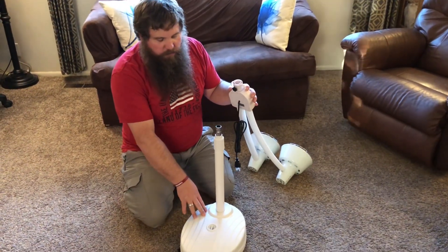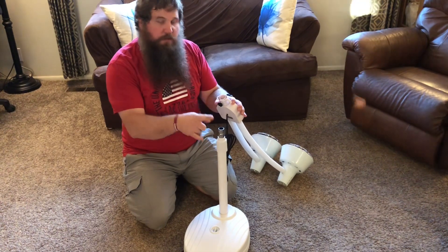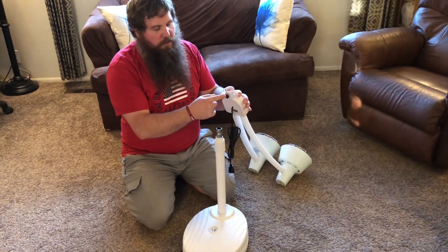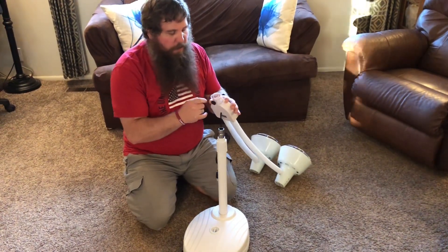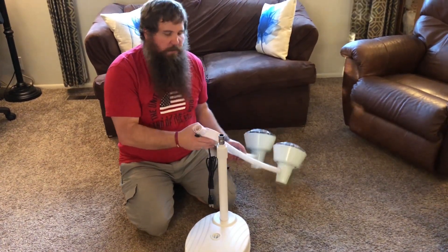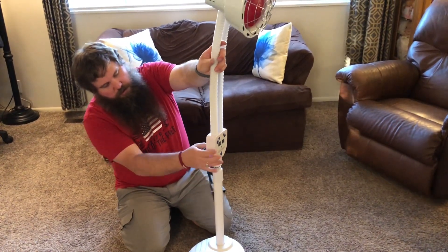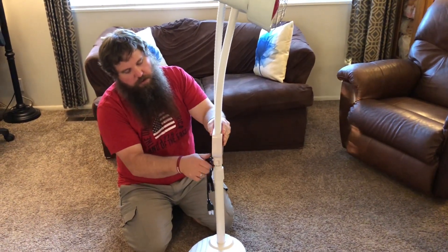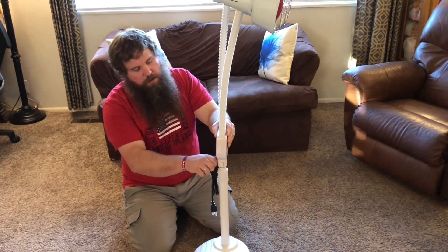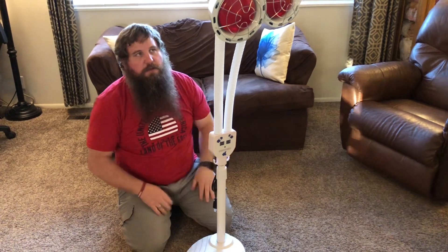I got the base filled up with some water, so it's nice and stable. Now I'm going to go ahead and attach the lamps to the post. There's a little nut on the back — you're going to want to loosen it up so that it's not sticking out. Then just slip this on top of the post here, and once it's on, you can tighten the nut back down.